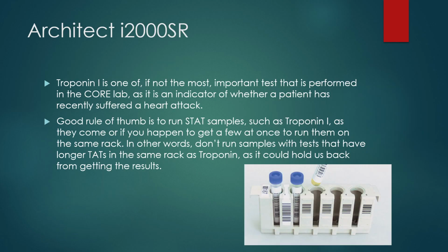Troponin I is one of the most, if not the most, important tests that we are performing in the core laboratory, which I work at. It's an indicator of a heart attack or a myocardial infarction.